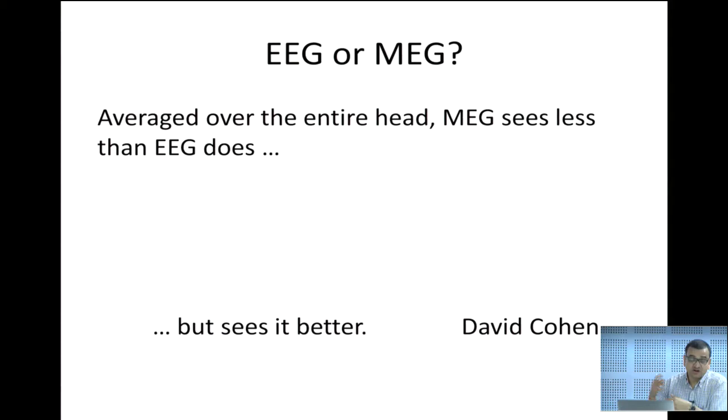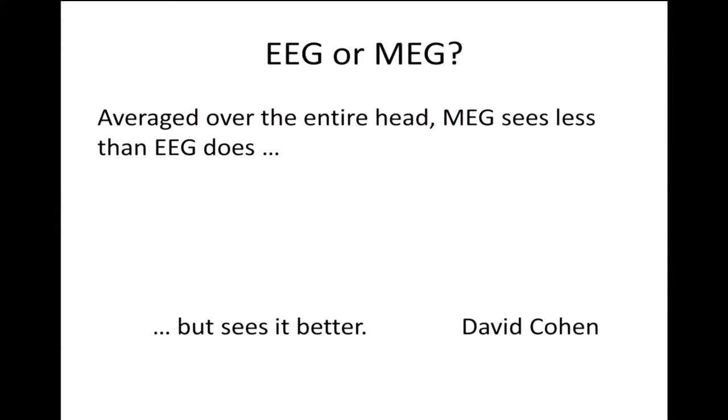They're the kind of stalwart in the MEG. But now, and for the last 10 years, there is quite a strong trend of bringing different imaging modalities together. So you can now combine EEG and MEG together. That's the recent trend, so you can get the best of both worlds. Instrumentation has developed so that you can use an EEG cap inside the MEG, but you have to pay the cost, naturally.